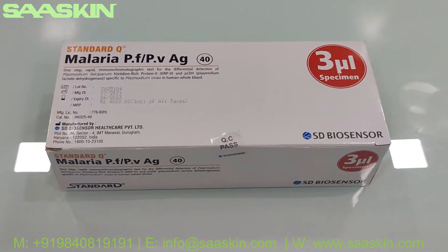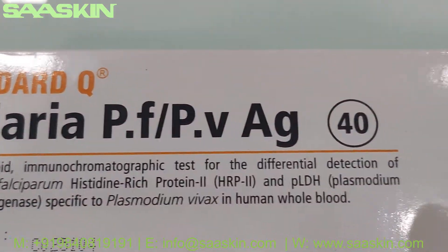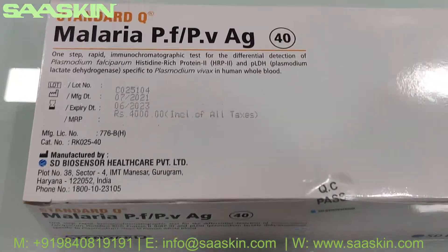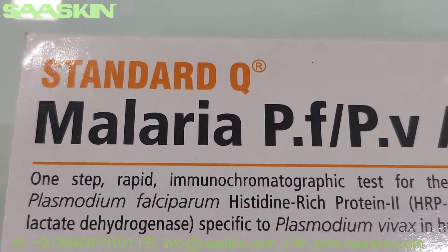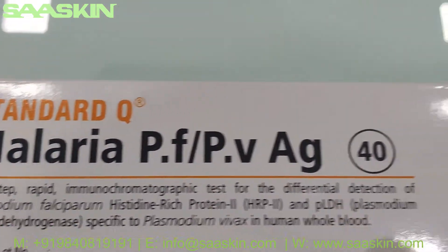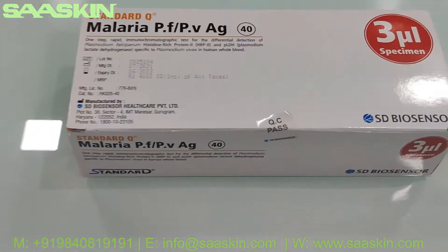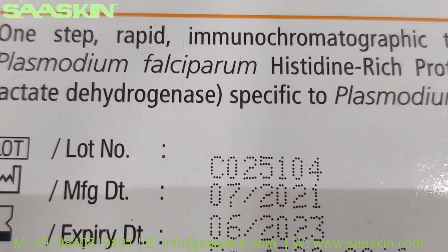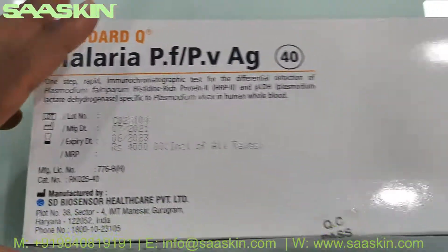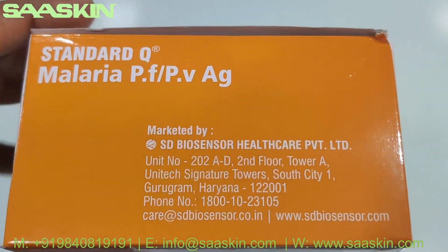Hello everybody, today we're going to see the unboxing of the SD Biosensor Standard Q Malaria PF-PV antigen test kit. This is how the box looks like. It is basically used with human whole blood. Around the box you can see the lot numbers, manufacturing date, and expiry date — typically the standard is two years. It is manufactured by SD Biosensor India.